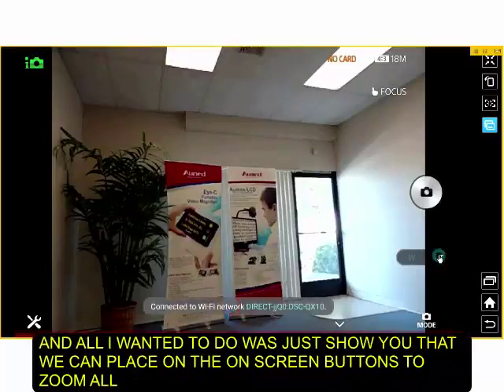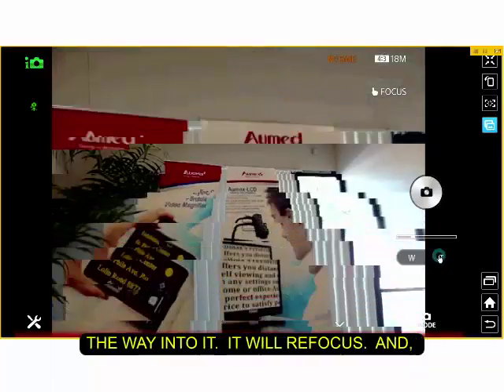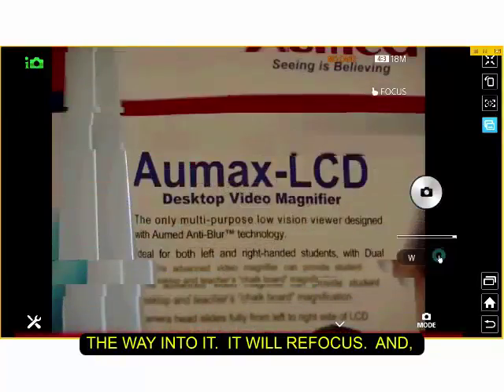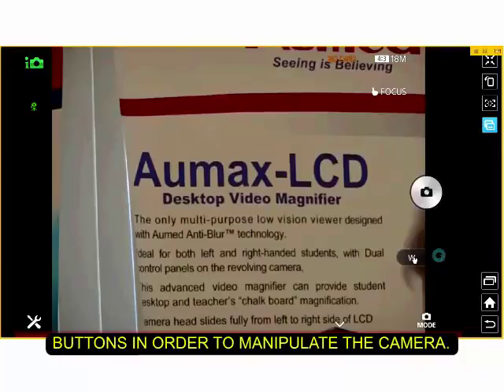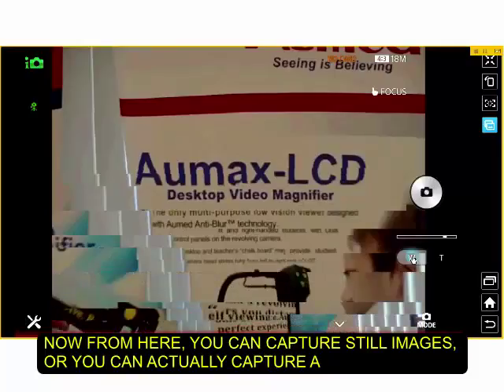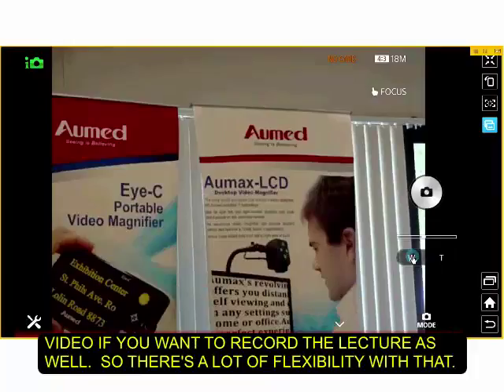And all I wanted to do was to just show you that we can use the on-screen buttons to zoom all the way into it. It'll refocus. And so at a distance, you can then start reading something. So again, it's quite easy. There's physical buttons on the side of the camera, or you can use the on-screen buttons in order to manipulate the camera. Now from here, you can capture still images, or you can actually capture video if you want to record the lecture as well. So there's a lot of flexibility with that.